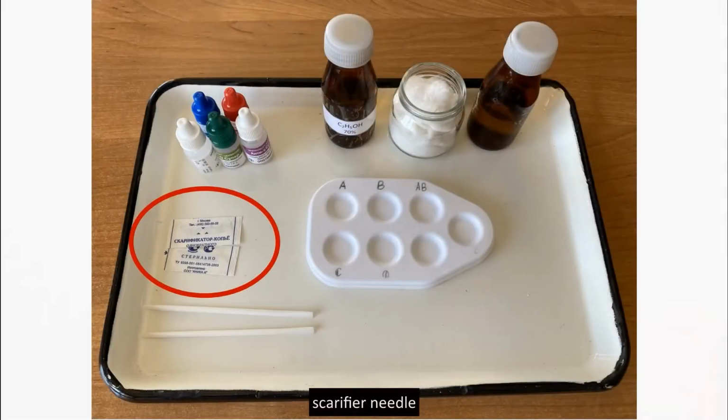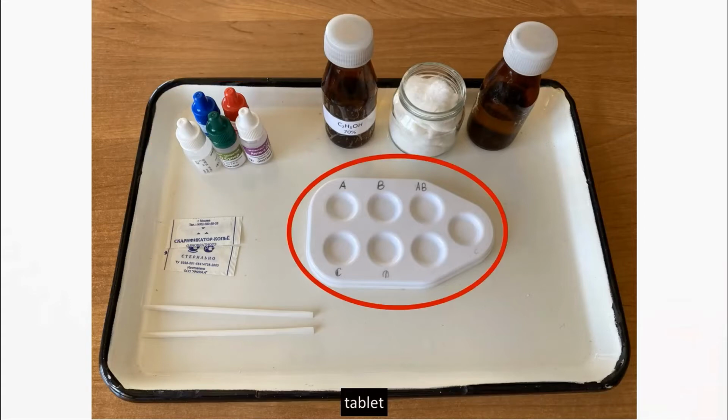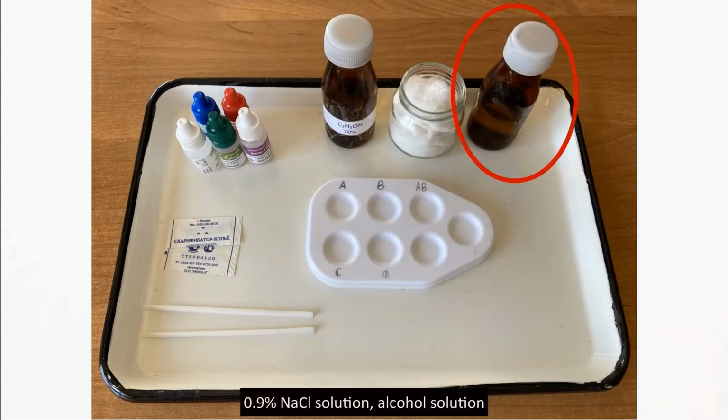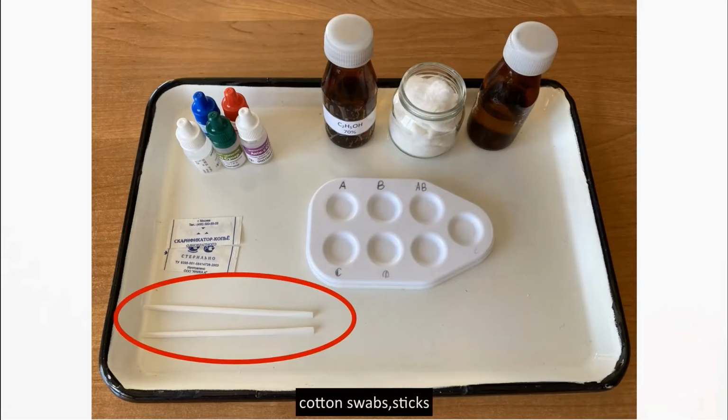Scarify needle, anti-A, anti-B, anti-AB, anti-D, and anti-C clones, tablet, 0.9% sodium chloride solution, alcohol solution, cotton swabs, sticks.